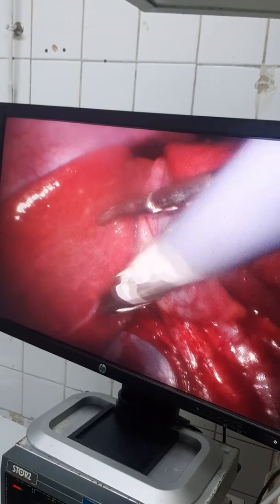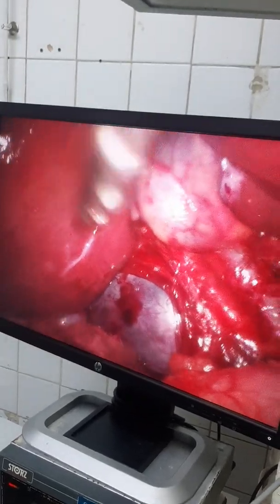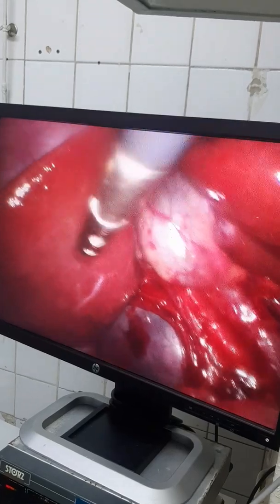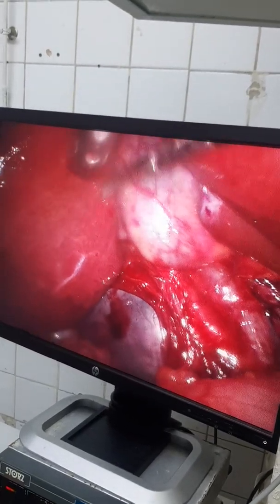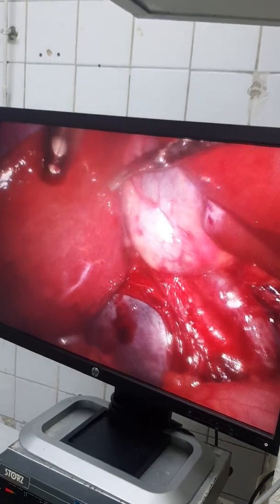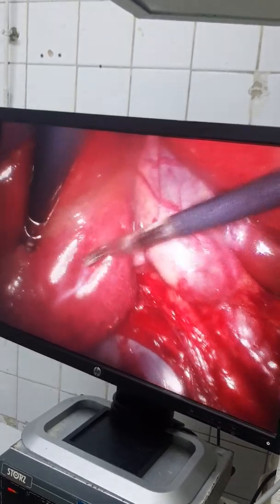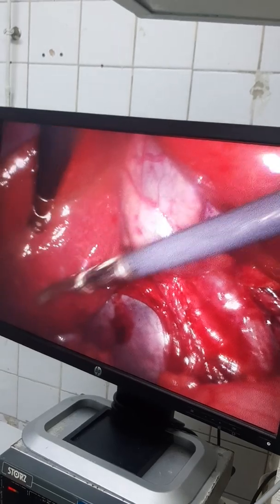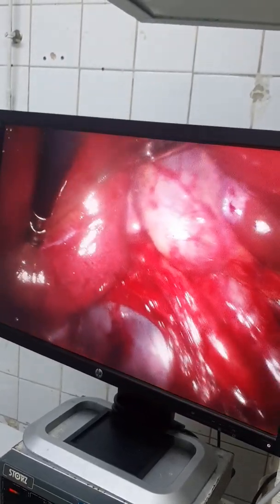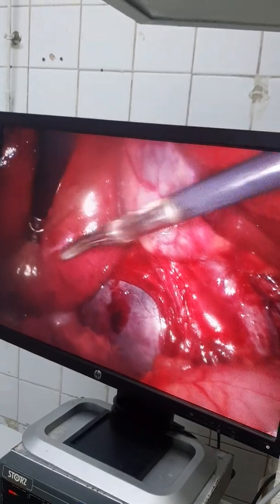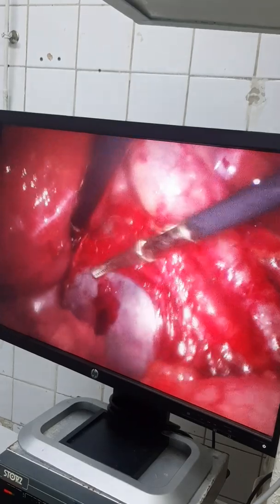Segment 8 is above segment 5 here. Segment 8 is still here at segment 5 while we are retracting the liver upwards, so we will not see segment 8 now. This is segment 8 of the liver, segment 5 of the liver, this is segment 6. Segment 8 is here above segment 5, and segment 7 above segment 6, and this is the cyst.